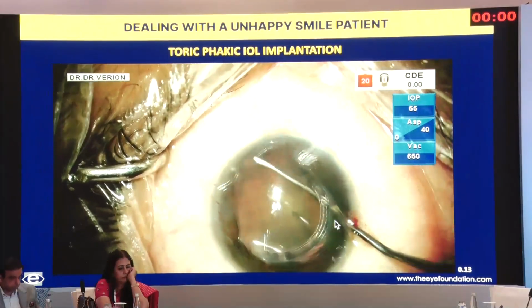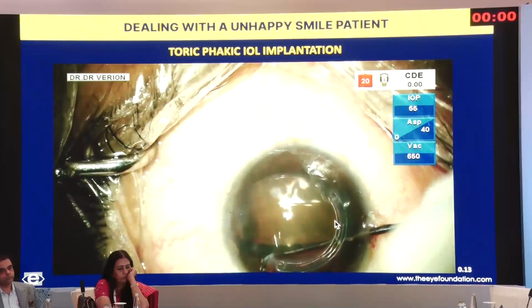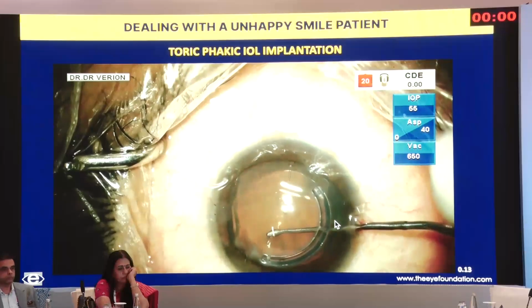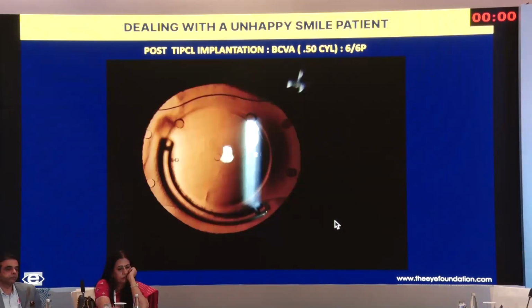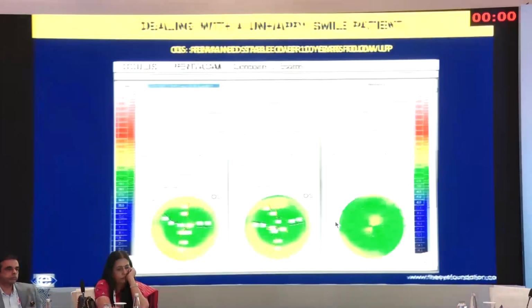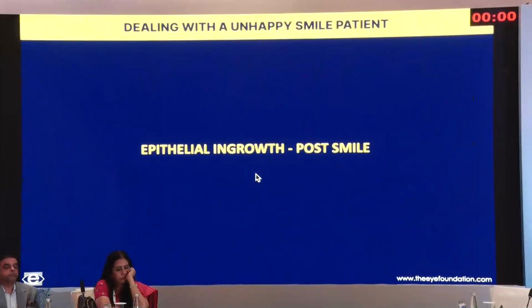So this is a patient who came for SMILE surgery, developed keratectasia in one eye, then subsequently we had to do topo-guided PRK with CXL, and finally a year later we could rehabilitate him quite completely with a phakic intraocular lens appropriately placed. And the surprising aspect is, even though the left eye had a slightly lesser refractive error, right through the 10-year follow-up, the left eye remained pristine and nothing really affected it. So both the eyes had undergone the same procedure in the same center.